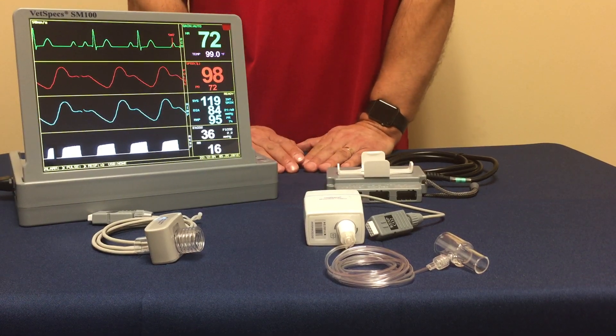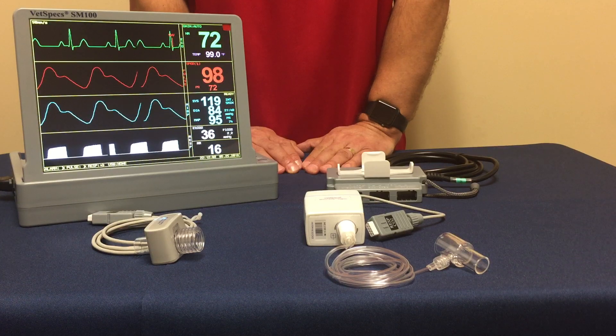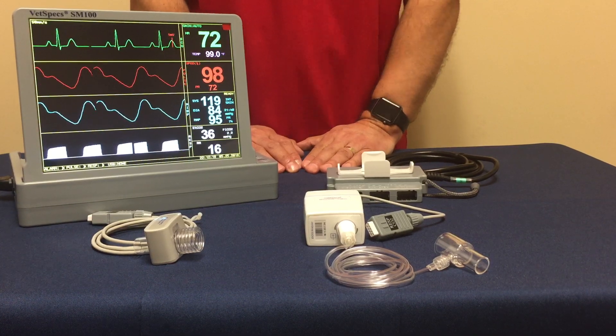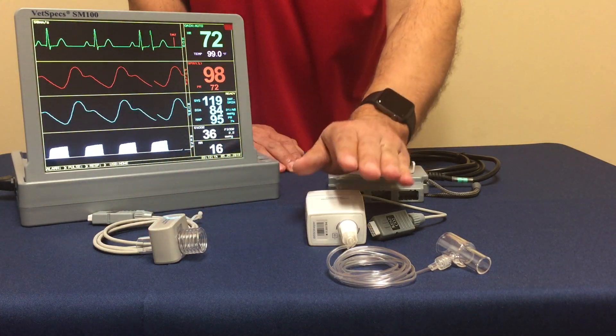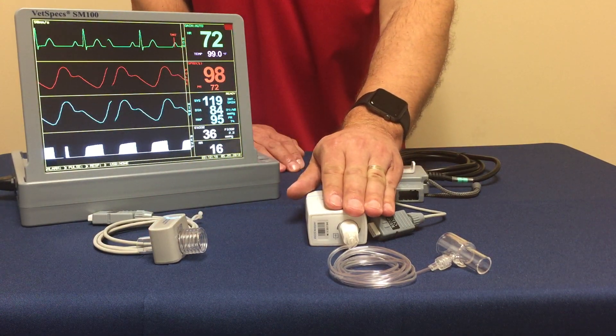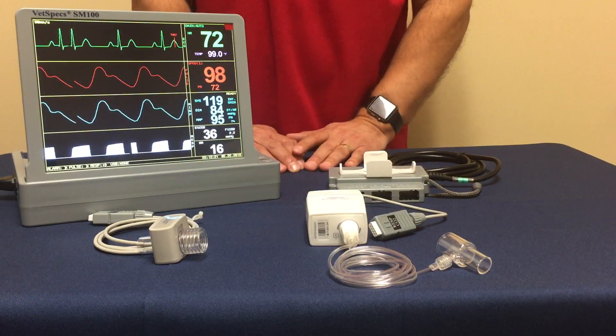VETSPEX offers two different methods or options for capnography for specific reasons: your mainstream CO2 sensor, and then your sidestream microflow sensor or module. These two options are available.